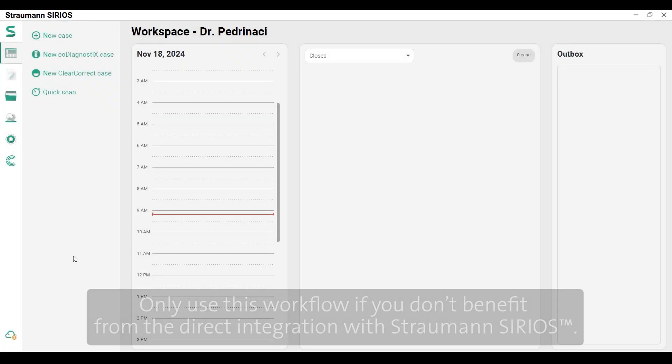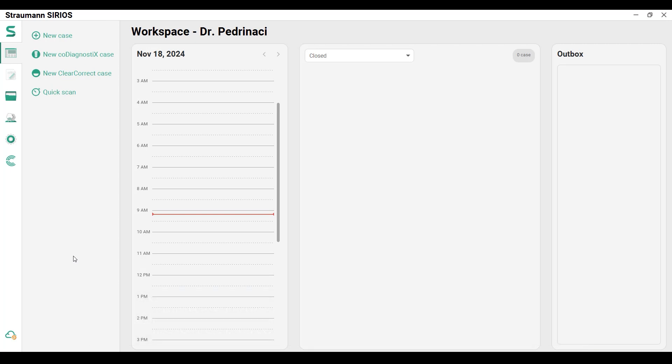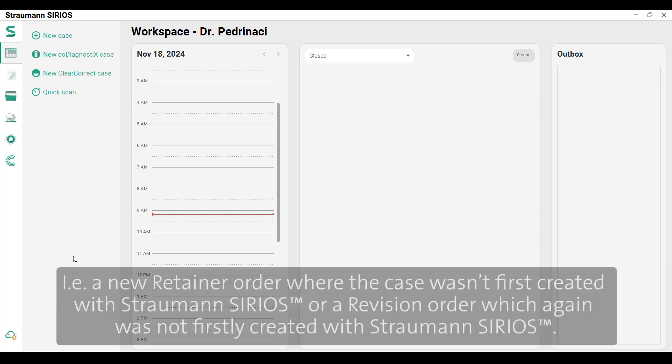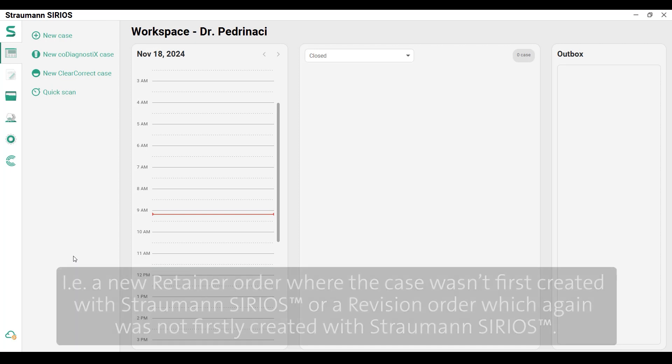Only use this workflow if you don't benefit from the direct integration with Straumann Sirius — for example, a new retainer order where the case wasn't first created with Straumann Sirius, or a revision order which again was not first created with Straumann Sirius.